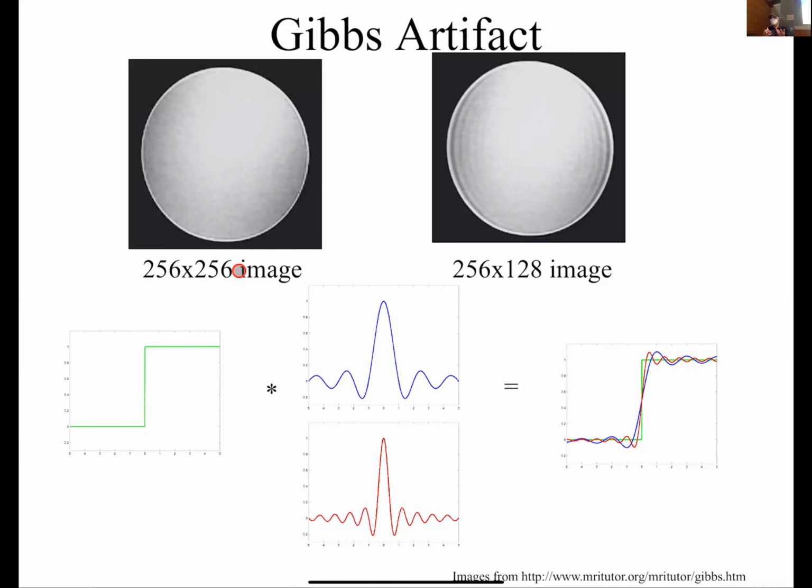So therefore I can ignore it. But they have to be pretty sure about that, because if it really is a problem and they just say it's an artifact, then they've made a misdiagnosis, right? So radiologists tend to be the physicians who actually have to have a little more technical knowledge than the normal MD, because they have to be able to understand what's an artifact and what's not.